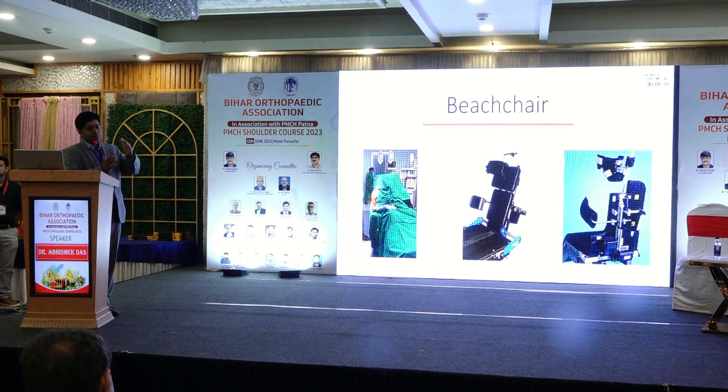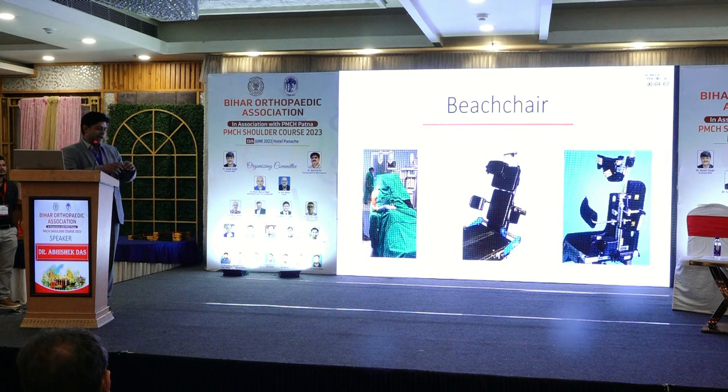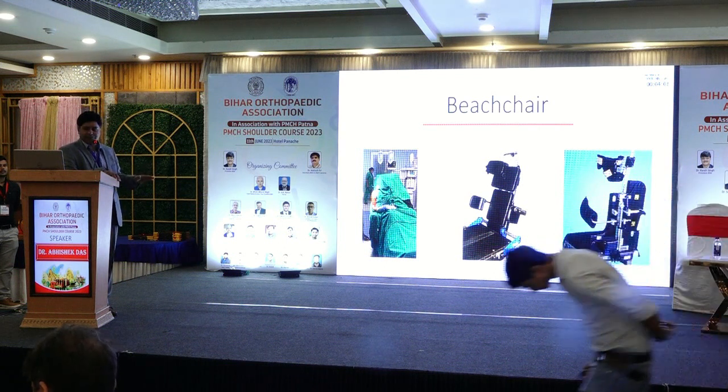Then I place the head ring, secure the head with lots of bandages, because you have to make sure that you do not cause any cervical injury. Now your shoulder is almost hanging off. Then I put a clamp on the side of the hip so that the hip doesn't fall off, and the clamp has got a handle, and the arm rests very well on that clamp.